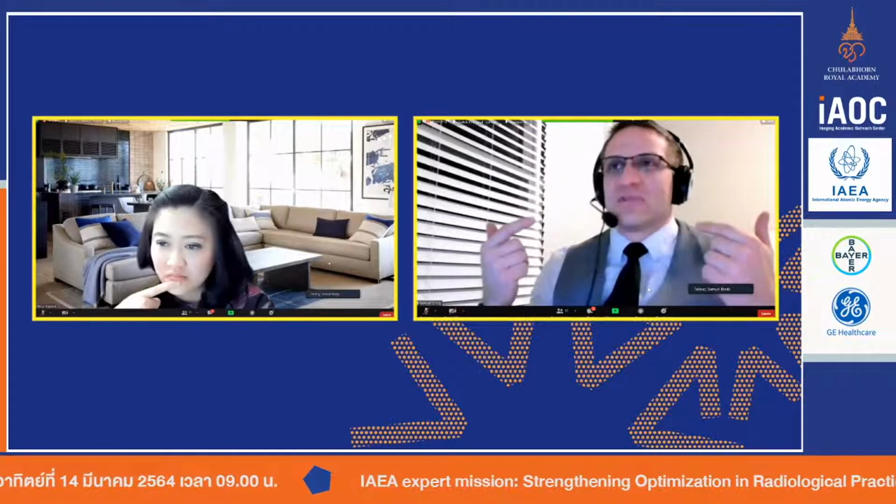They have the shakes, or maybe they have dementia, so they don't pay attention as well. If we can go really fast, we can hopefully capture that. They may not be perfectly cooperative, but we can still get them on the scanner, get them as comfortable as possible, and then boom, we're done. That's the most perfect world.